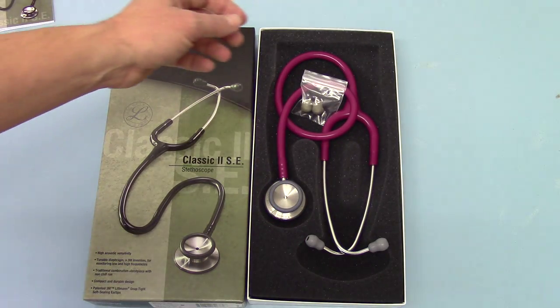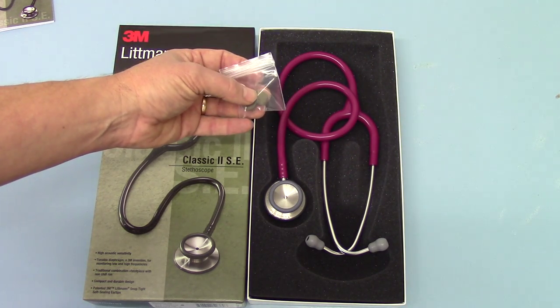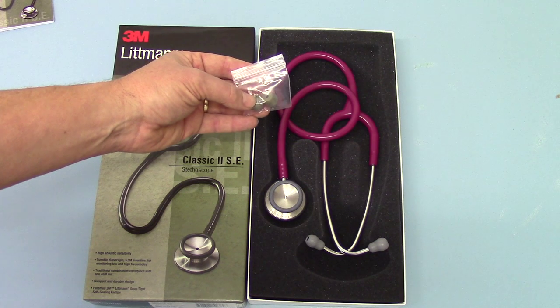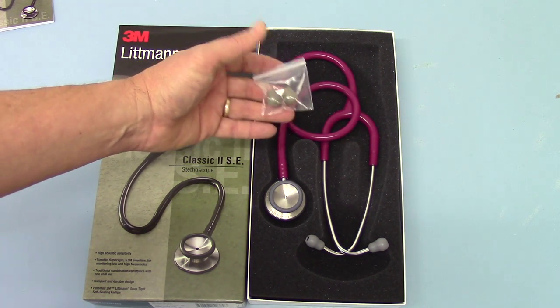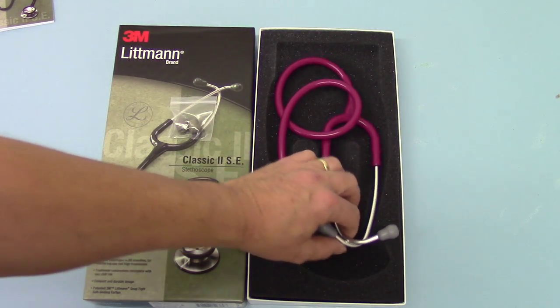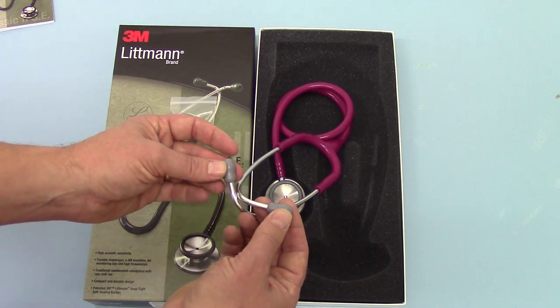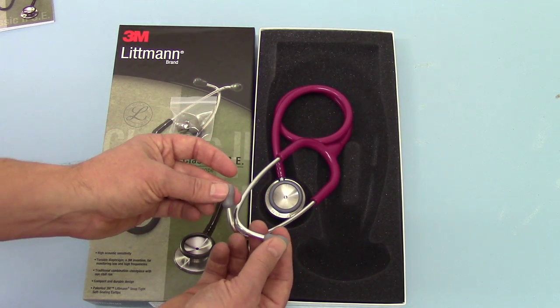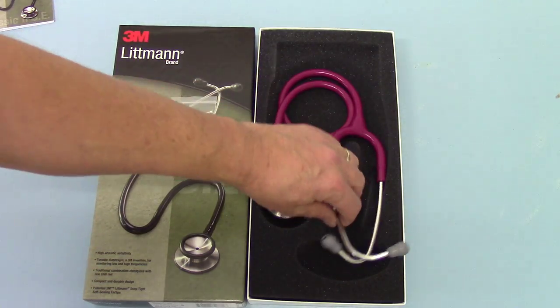And then the stethoscope itself — if we show you what spares you get: with the Classic 2 SE, the only spares packed in with the unit as standard are two very firm, hard, small eartips, which is an option. But the unit is actually preloaded with soft, medium-sized eartips, which most users find more comfortable than the firm, old-fashioned eartips.